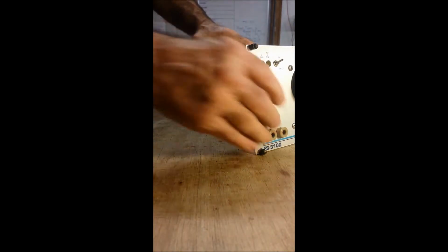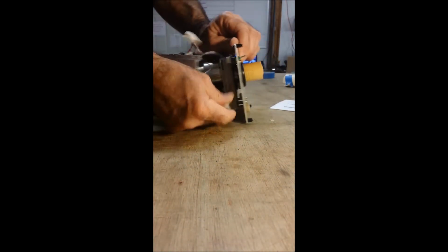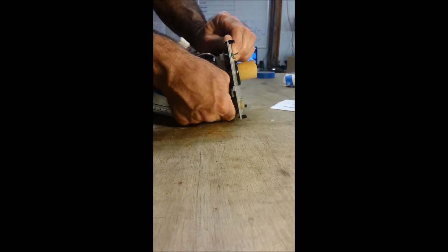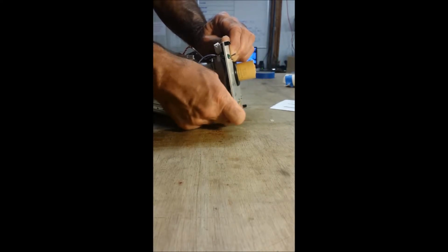When you put it back in, then you feed the valve module in, drop the heater in, and then you've got to reach in here and connect the inlet and outlet fittings of the heater. Always check to make sure none of these are leaking when you're all finished. Get some flow going and check down in there.